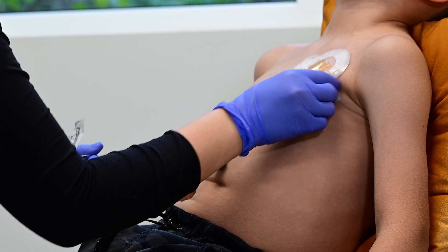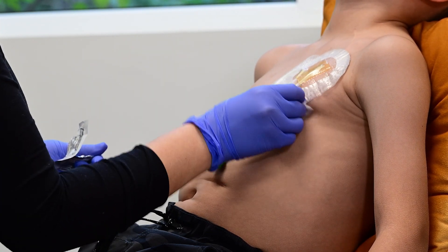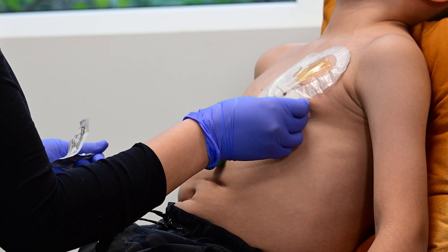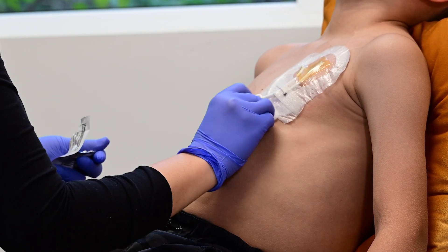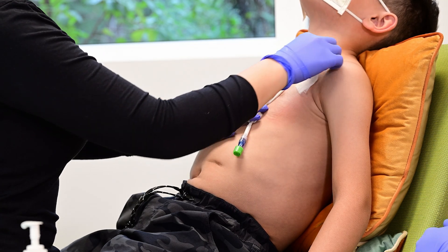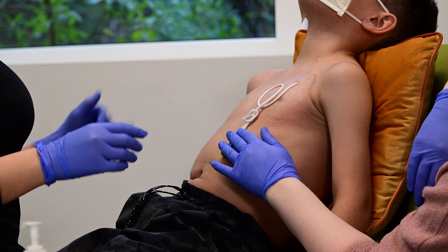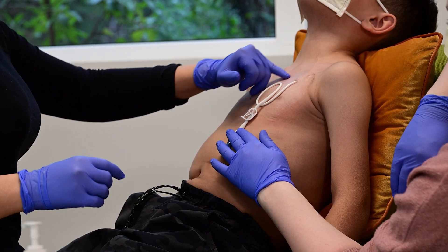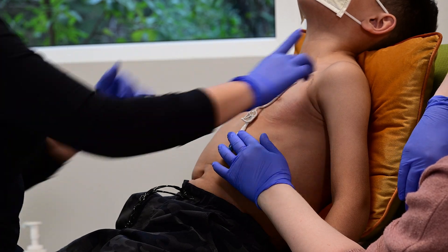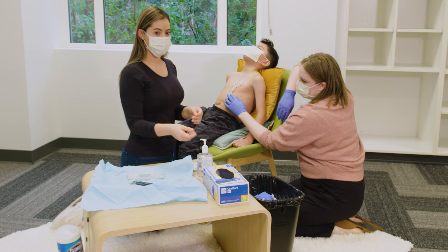If needed, ask about working with a child life specialist who can help make a coping plan and offer other support for your child. Throw away the old dressing. Take a moment to look at the skin around the central line — the skin should not look infected or irritated. It should look the same shade as other parts of their body, with no swelling or oozing. Remove your gloves and use hand sanitizer.